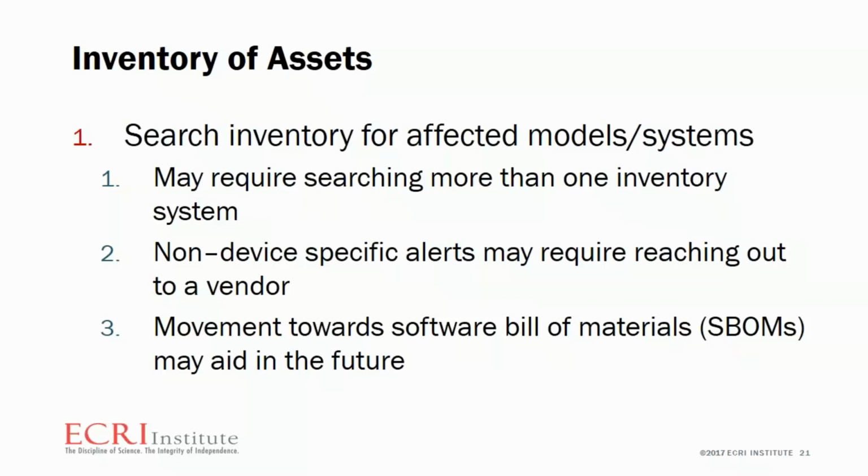Inventorying the assets. This would be searching for affected models and systems. Your IT department may have an inventory, and your clinical engineering may have another. You need to work together to develop a cohesive inventory to be more comprehensive. In the case of a non-device specific alert, such as a vulnerability to an operating system, you may need to reach out to the device manufacturers to find out if that particular device is affected by this.